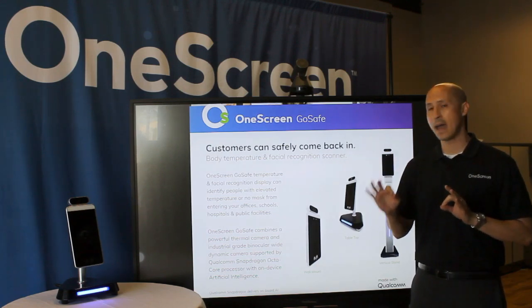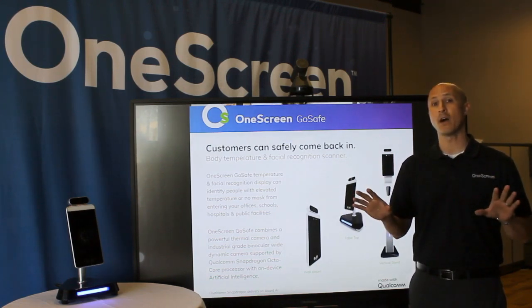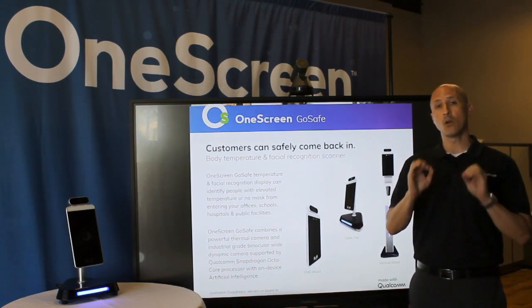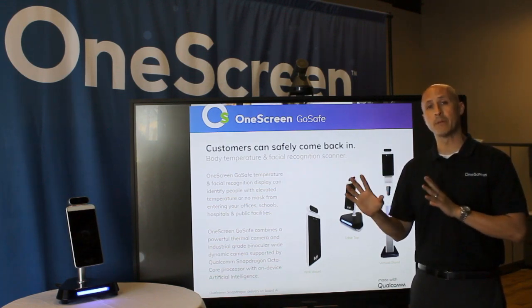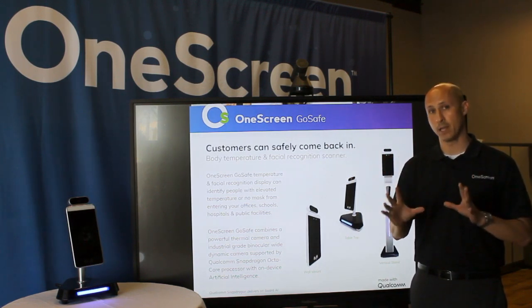Using a variety of access control interfaces, this will also allow you to open any kind of automatic door or gate. Additionally, you can deploy GoSafe in standalone mode, you can manage them via an on-premise server, or you can deploy a cloud to manage a global OneScreen GoSafe fleet.